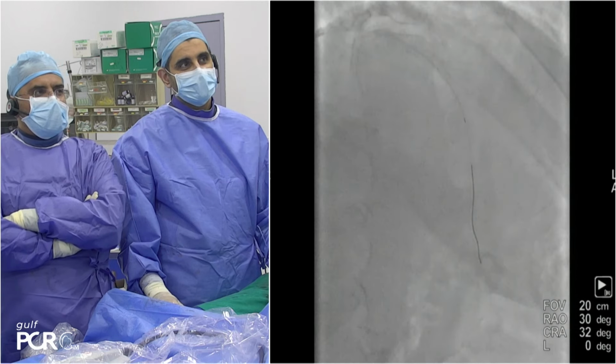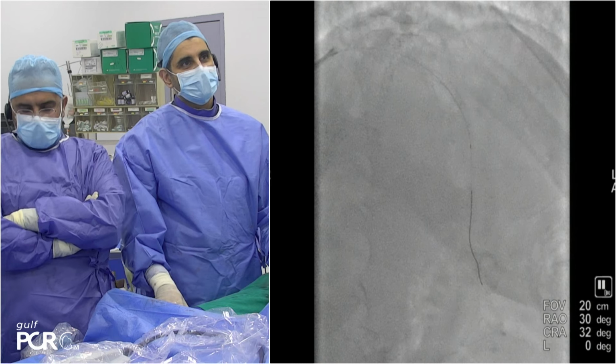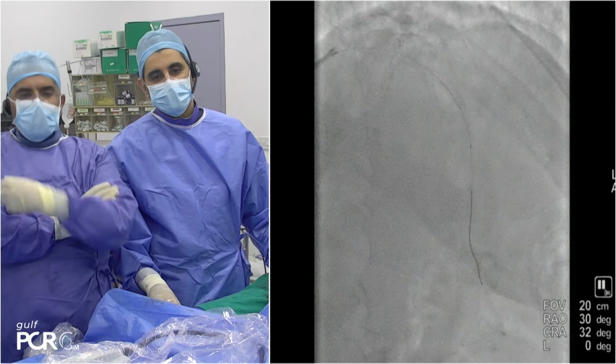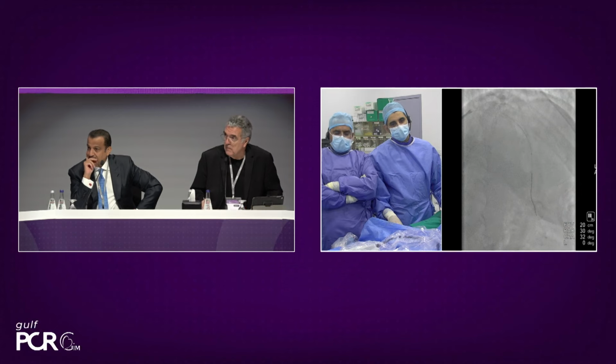I mean, this is a very diffuse disease, and we can have different strategies. And this is the beauty of this imaging, that you can have insight into this vessel and understand what else could be done. Everyone would have a different strategy, but at the end, the flow is good, and the objective is done. We have treated the nodule successfully.